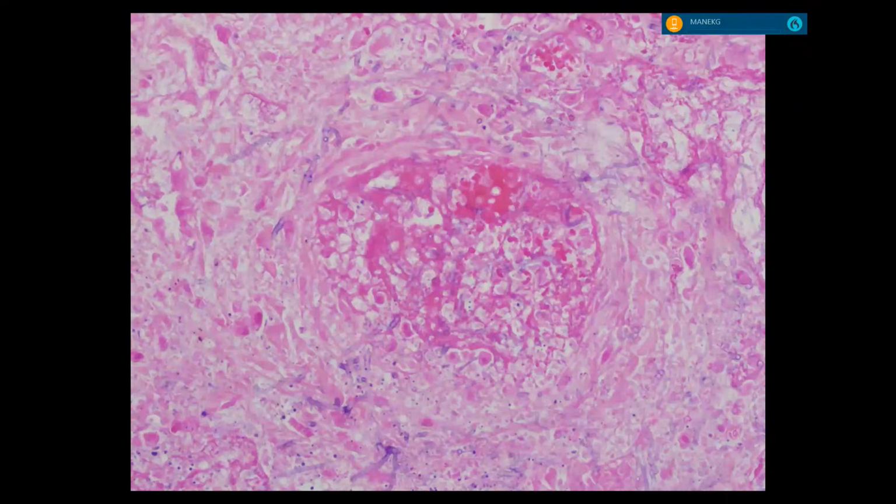All right, guys, no stem so far. I see some hyphae. Very good. Filamentous fungi. Mucor. Okay, you're almost there. You brought it almost to the answer: filamentous fungi. Anything else in the picture besides the fungi? Trying to see if there's more. This definitely doesn't seem like Aspergillus.